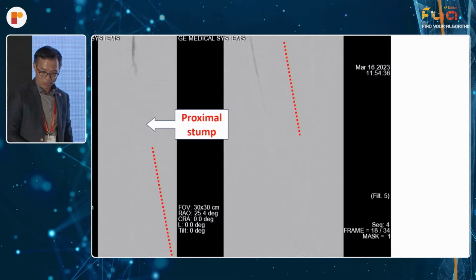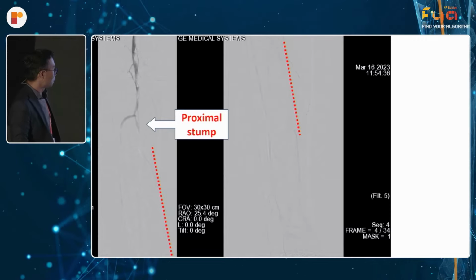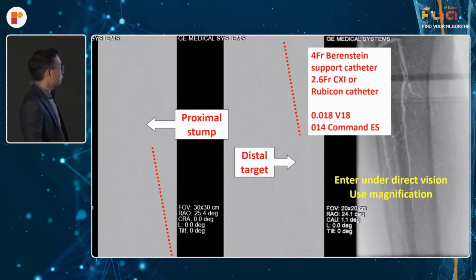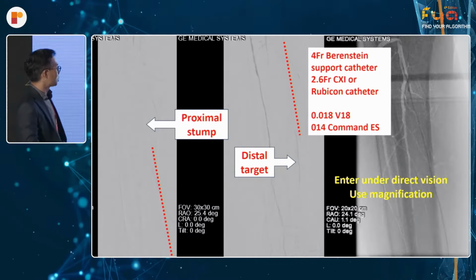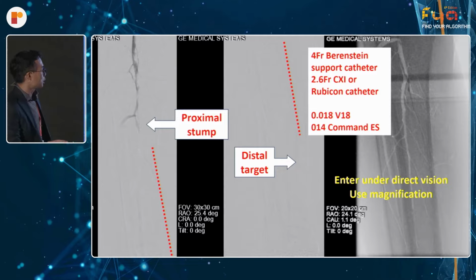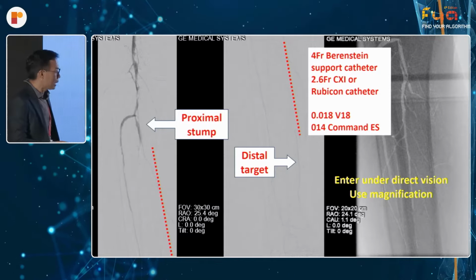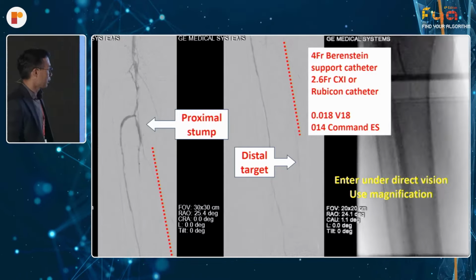So I'm going to start with a relatively straightforward case. This is a patient with a CTO of the posterior tibial artery. You can see a nice proximal stump and a nice distal target. So with this kind of picture, this is my normal technique. I would use either a 4 French Bernstein support catheter at the top. If it's further distal, I'll use a smaller microcatheter, either a 2.6 French CXI or Rubicon. My workhorse wires are the V18 or the 014 Command ES. And from there, most of the time you can quite easily find the microchannel, and the wire will then sail through like this case.